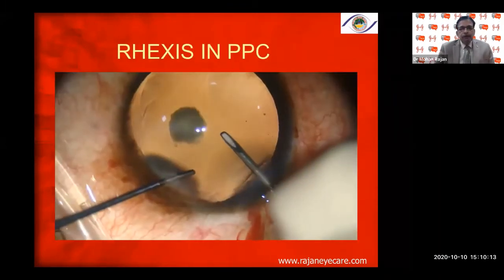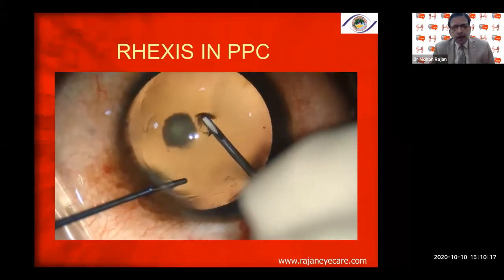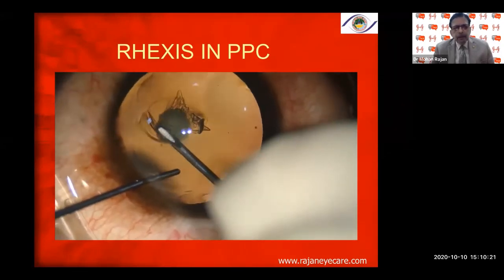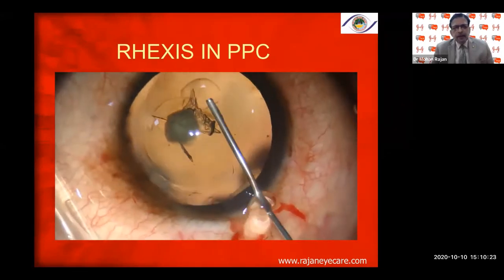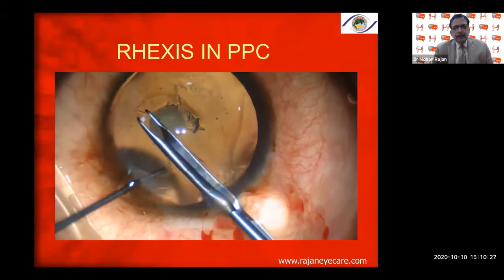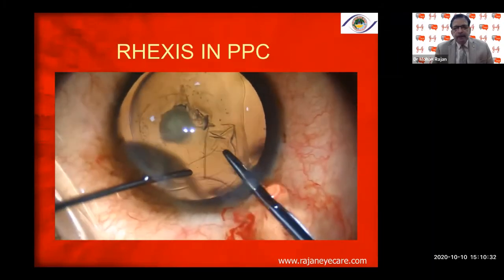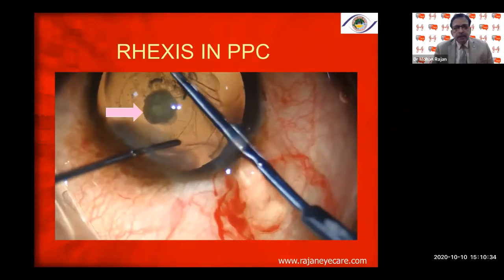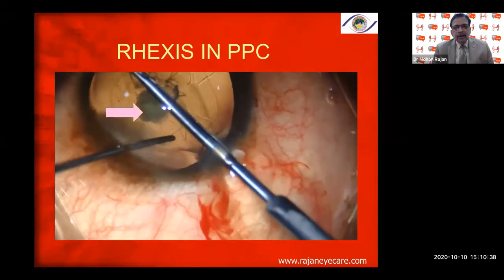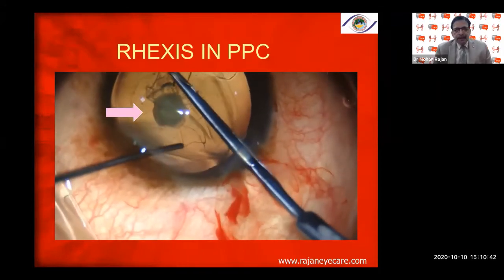The preferred rhexis size is about 5.0, 5.25, or 5.5 millimeters, depending on the type of lens you are going to implant. In a posterior polar cataract, aim for about 5 millimeters because in case of a posterior capsule rent, you can put the lens in the sulcus and capture it. I am using a micro capsular rhexis forceps, and every time I re-grasp the capsular rhexis margin.